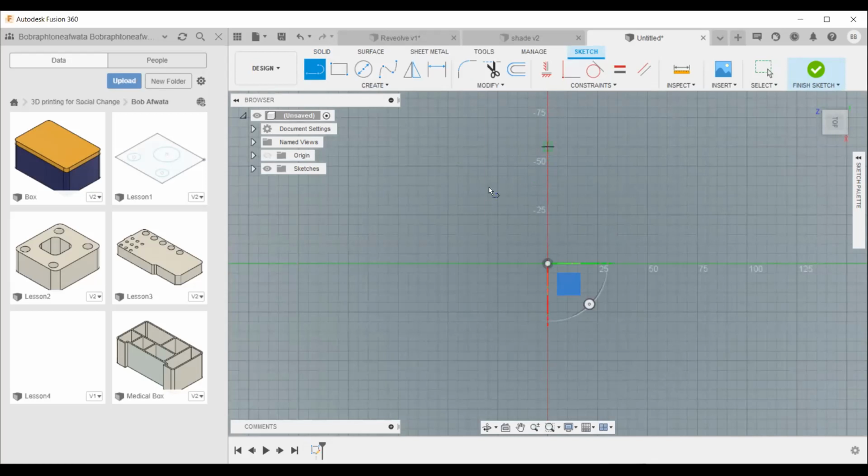For those who are stuck, I want you to draw a simple one like this. Ndio muone. Those who are stuck, I think this one everyone can be able to draw. Guys, just draw along with me. You just start a new design. The other one was complex to do, but I think we can do this simple one together.